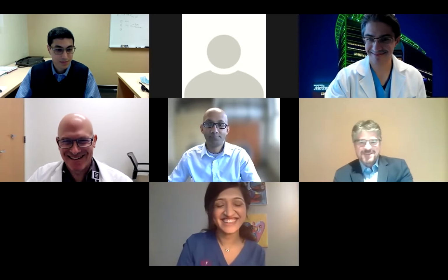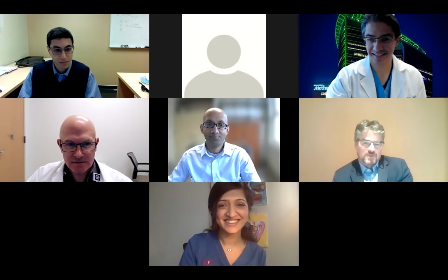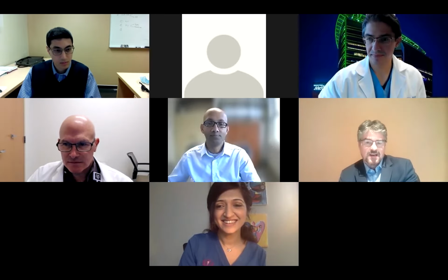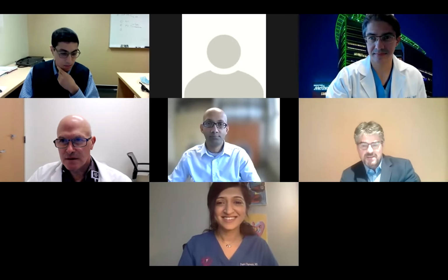Thank you very much. Welcome everyone for joining us tonight. I had to learn again how to unmute myself. It's my pleasure to co-moderate today's webinar about a really important topic, myocardial perfusion imaging, especially in view of the new US guidelines, which place CMR in the forefront. So a lot of action, a lot of changes. We're moderating this together with Faisal Nabi from Houston Methodist Hospital in Texas, Chris Kramer from the University of Virginia, and myself from Frankfurt University in Germany.